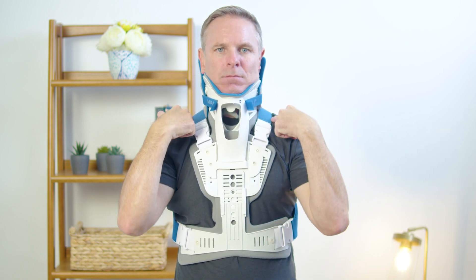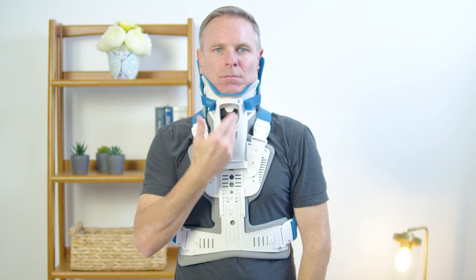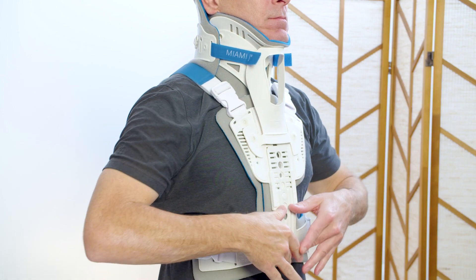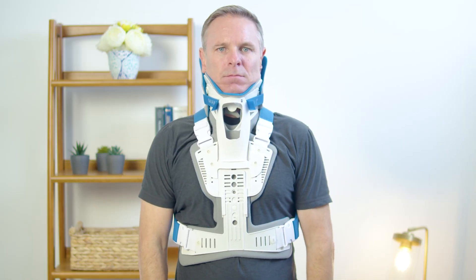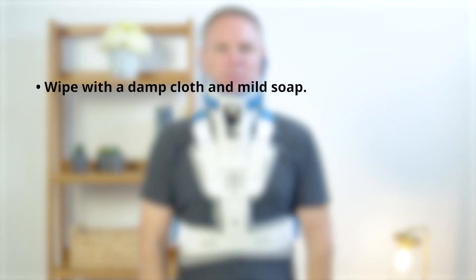The lower plastic edge should not be resting on the clavicles nor digging into the trapezius. Front and back panels are centered on the body with no plastic touching skin. Pads extend beyond all plastic edges, and there is no slack or gaps in any of the straps.